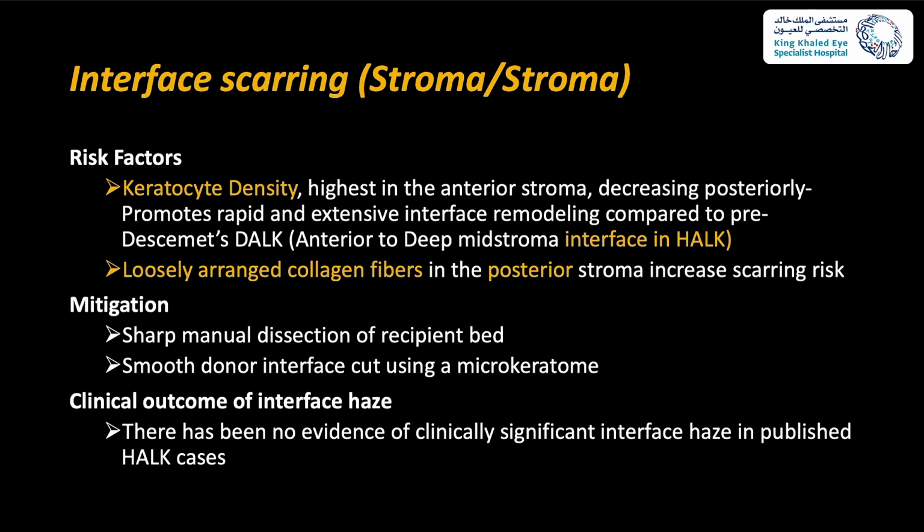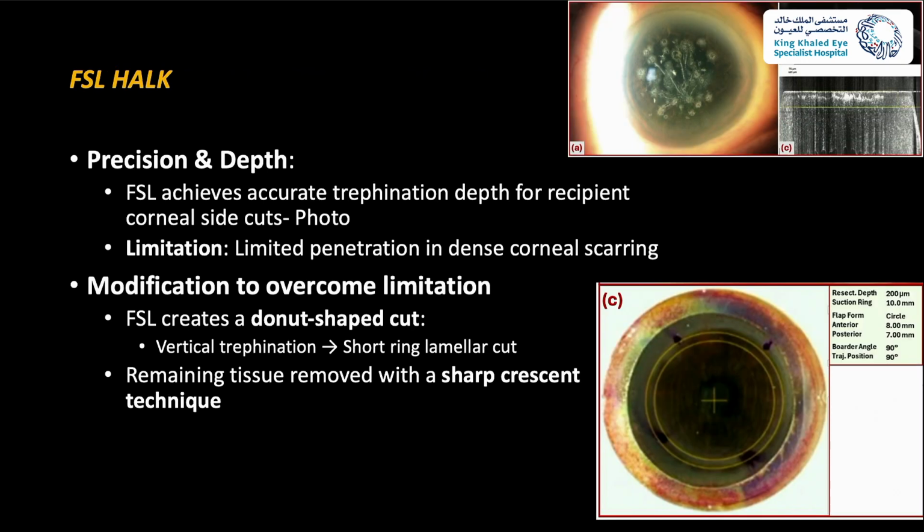What about femtosecond? Can we apply femtosecond in cases where we don't have the microkeratome system, or maybe we don't have the adjustable trephines, or we're not that accurate? So femtosecond laser was reported to be used in HALK, even in an Avellino case, where the vertical trephination, it is well known that vertical trephination using femtosecond laser is very accurate. However, the interface or the lamellar cut of the femtosecond laser is not as accurate as the vertical trephination.